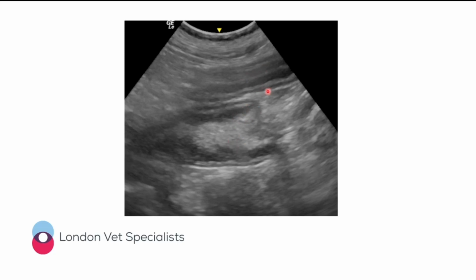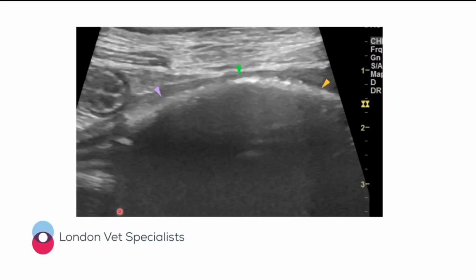It's difficult to say that there's two distinct populations here. There's maybe just a single population. However, on closer examination, we can see that this is small bowel. That's probably also small bowel here. And again, we've got this big shadowing structure within the lumen of the small bowel. So that's certainly something to take note of and to be concerned about.